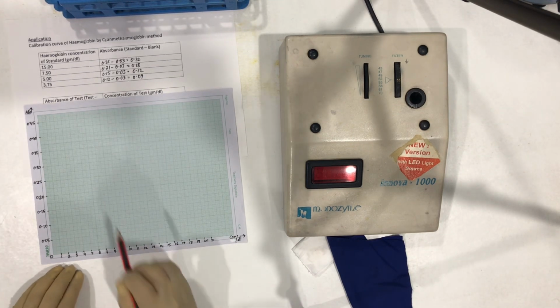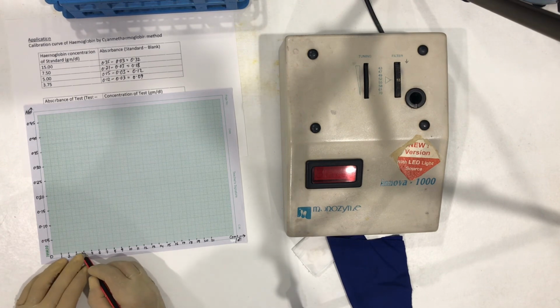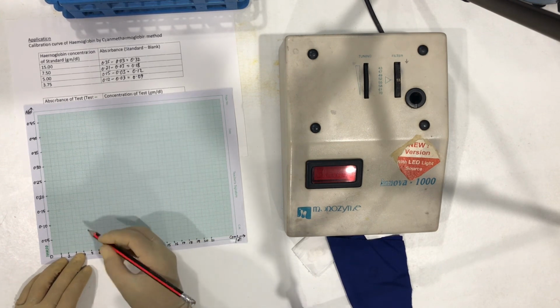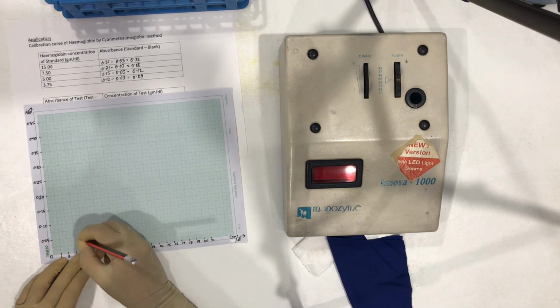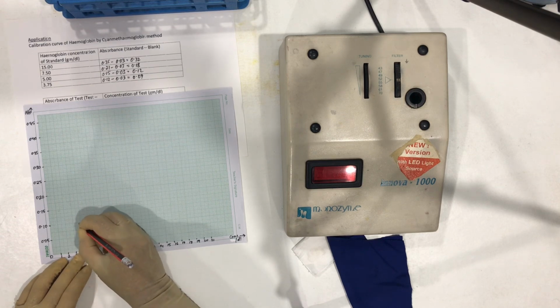So standard 3.75 is giving absorbance of 0.09. So that will be, okay, out here, 9 means, okay, 1 2 3 4.